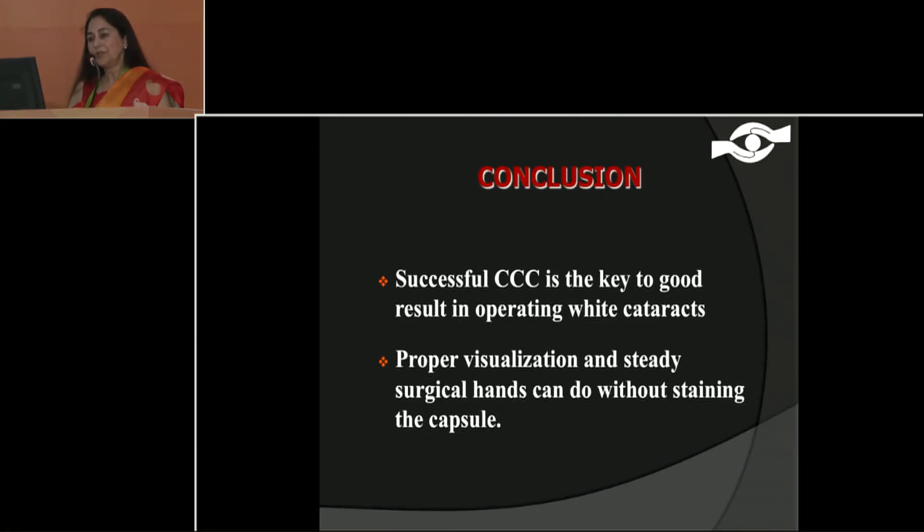In conclusion, successful CCC is the key to good results in operating white cataracts, and proper visualization and steady surgical hands can achieve this without staining of the capsule. Thank you very much.